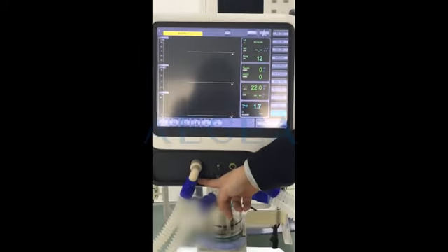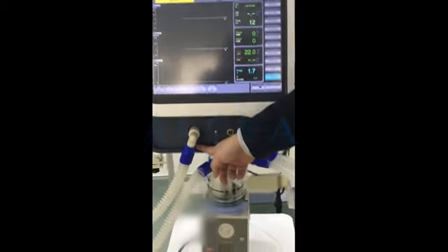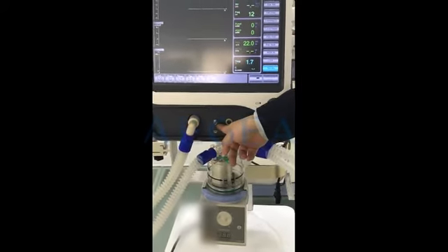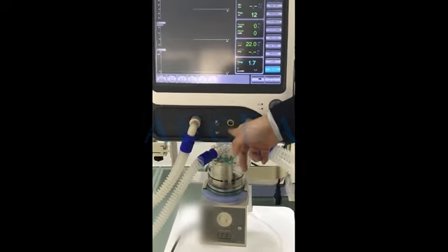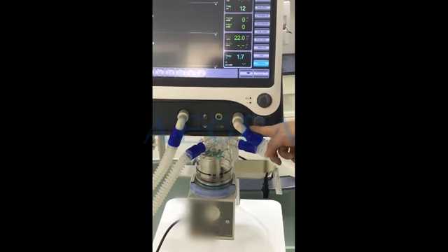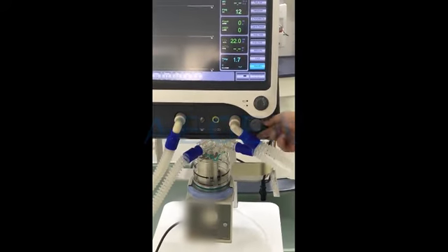Here you can see the expiration port, here is for the nebulizer function, this is the ETCO2 port, and here is the inspiration port.